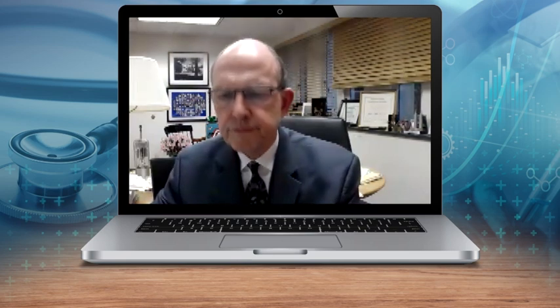So, what kind of cancer patients could this be used for? It can be used for a variety of pediatric and adult cancers. In pediatric patients, it's especially important because the tissues are very sensitive in these patients, and it will cause less harm to these normal tissues of children and really reduce the late effects associated with conventional radiation therapy.